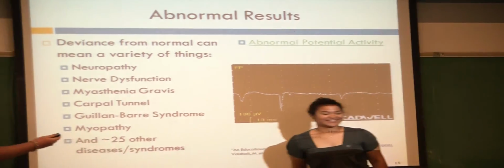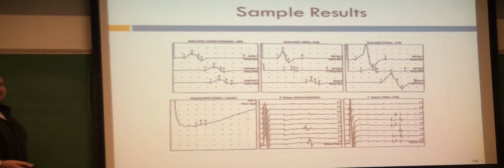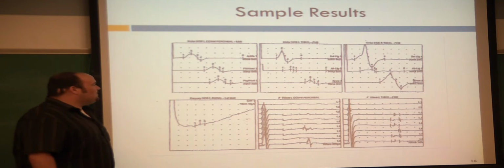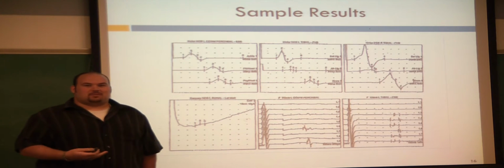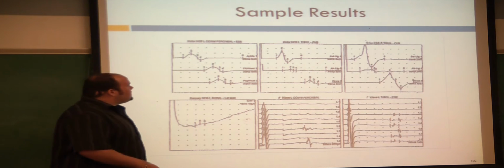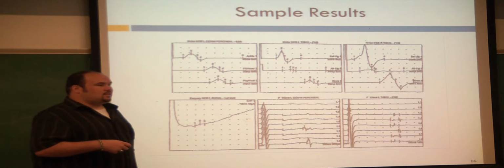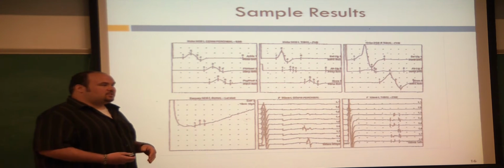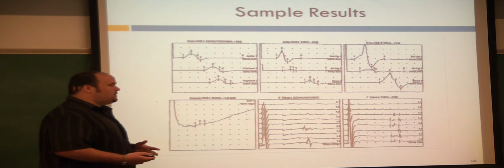So to really understand what an EMG is used for and its value, we were able to get our hands on some actual results from someone that went in for an EMG and nerve conduction test. And as you can see, the very first one they did, the patient came in complaining of severe right foot pain, and just at random times, they'd be walking, sitting, it didn't matter.